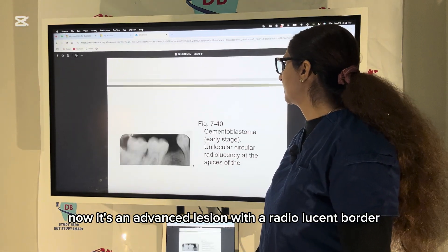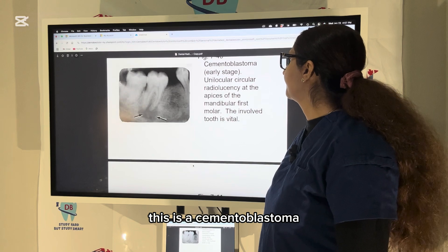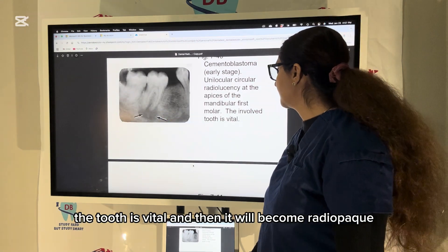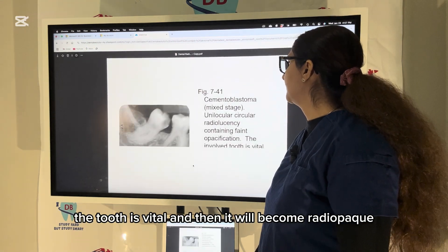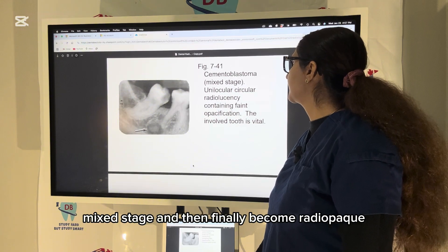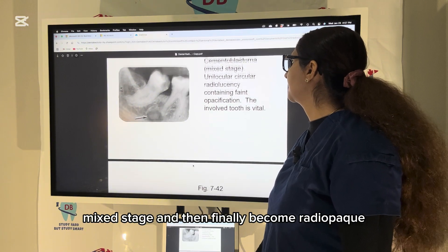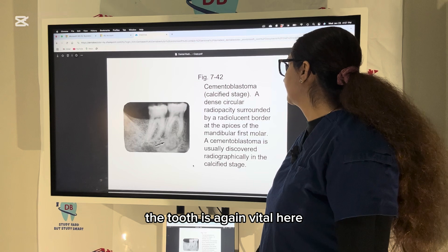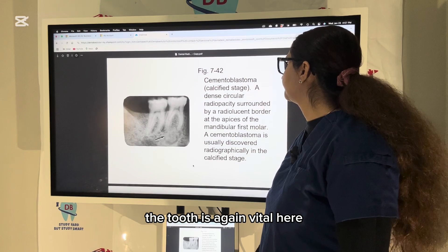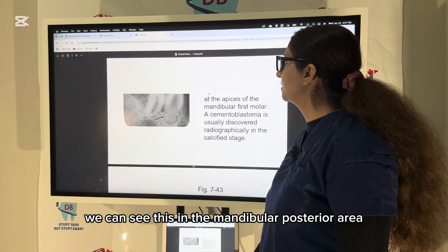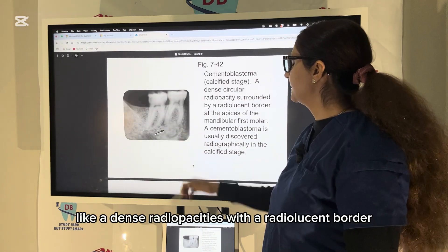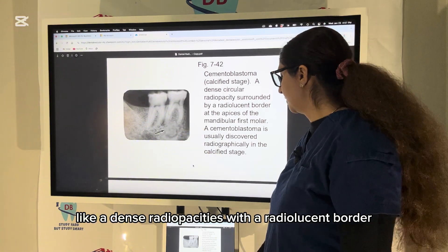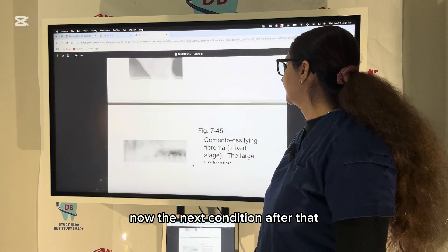This is cementoblastoma. In the starting stage you see radiolucency; the tooth is vital. Then it becomes a mixed radiopaque stage, and finally a calcified, radiopaque stage — the tooth is again vital. You can see this in the mandibular posterior area as a dense radiopacity with a radiolucent border.